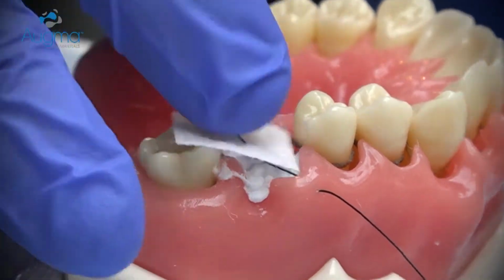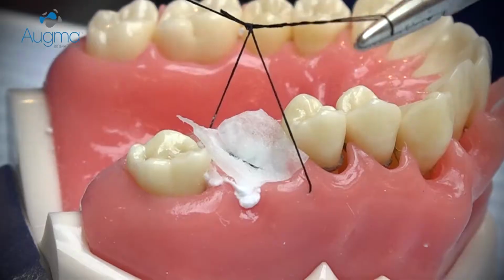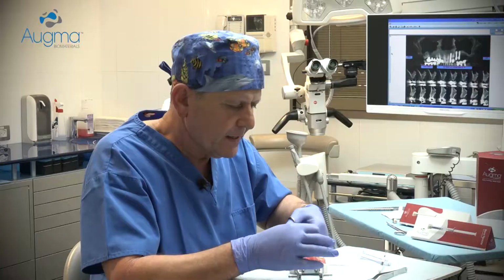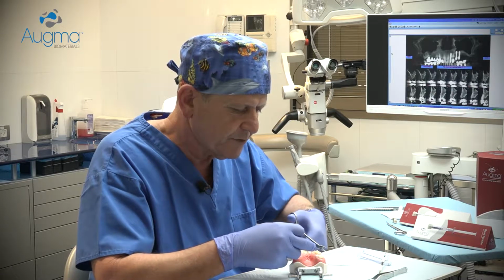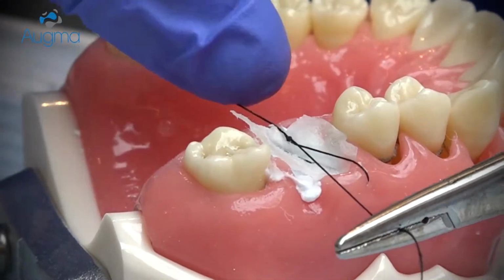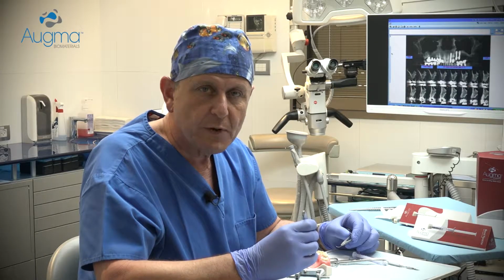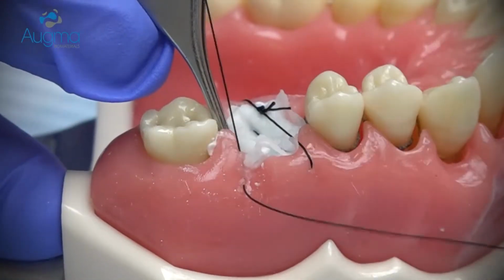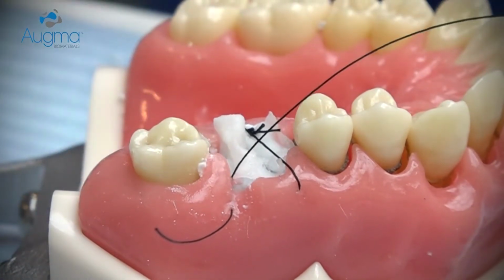Place the sponge above the grafted site and make your first suture to stabilize the collagen sponge in place. Now remember that the collagen sponge must be stabilized together with the soft tissue by its first knot. After stabilizing the collagen sponge, or the membrane, in place, you continue with a crisscross suturing in order to protect it in a better way.